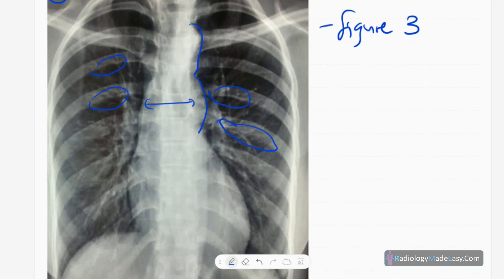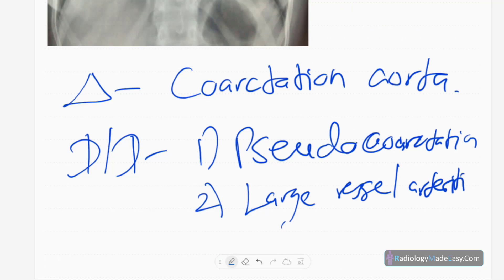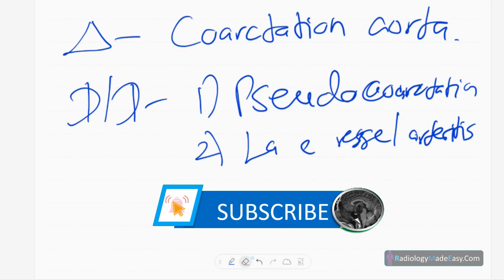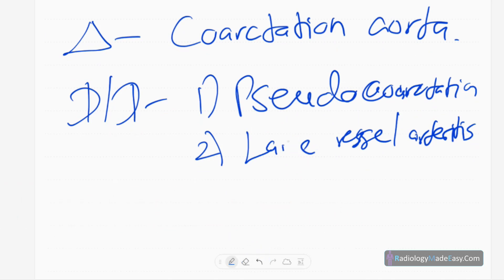For this kind of finding, the differential diagnosis includes pseudo-coarctation and large vessel arteritis. In large vessel arteritis, there can be dilatation of the arteries and sometimes aneurysms of the aorta, which can mimic that figure-3 appearance.